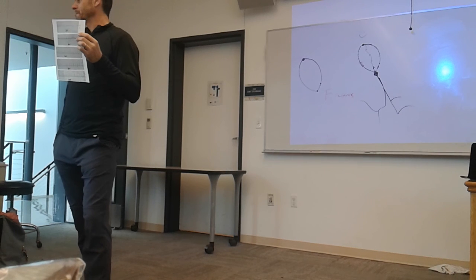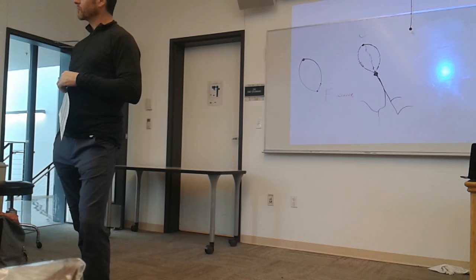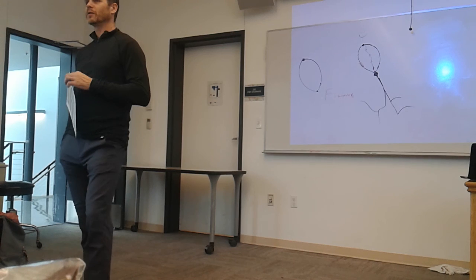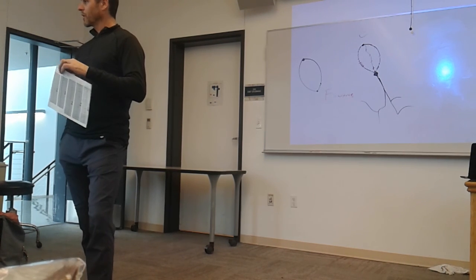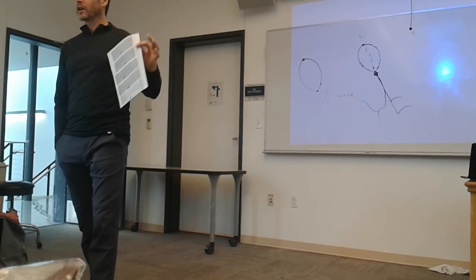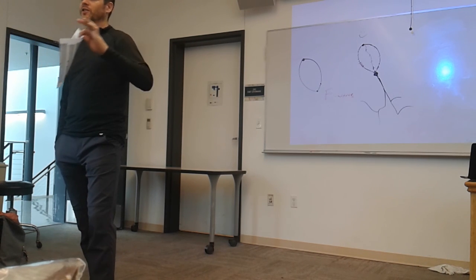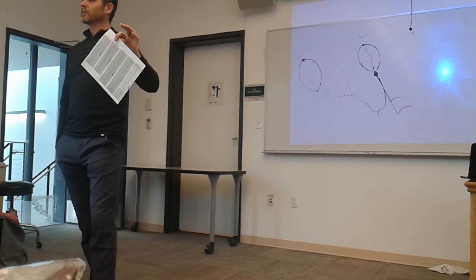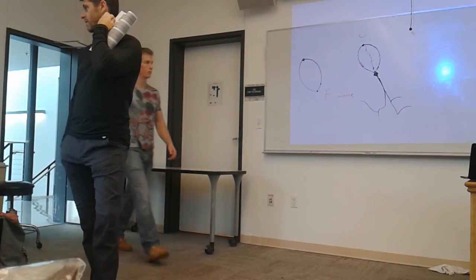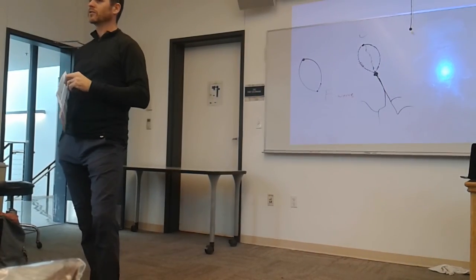So you just treat rate? Well, now the question is, are we treating rate? Are we treating the patient? What's the problem with the patient? Right? So last week, we discussed that there are times where you look at an EKG and you take the clinical correlation with what's going on with the patient, and based on that information, you have to treat the EKG in order to treat the patient. Other times, you have to treat the patient in order to fix the EKG. Right? And you need more information than what you're seeing here, because you need to actually look at the patient too.